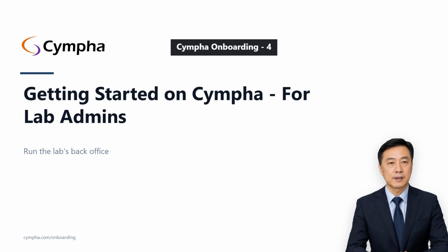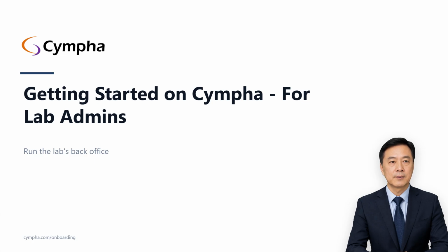3 names first, as in the other sessions. Guide Mia is the company. Cympha is the online platform your lab runs on. Guide Mia also makes the desktop design programs your technicians use, which are not part of this session. Our example is David, the admin at Apex Dental Lab.